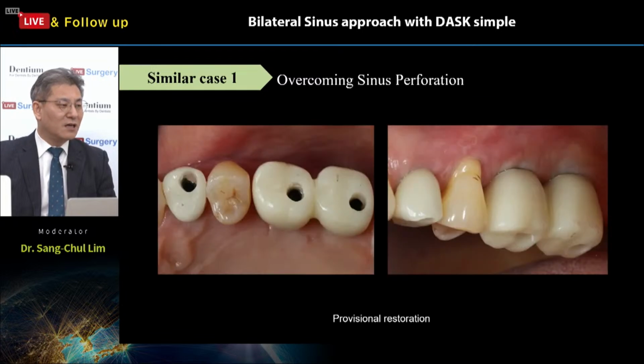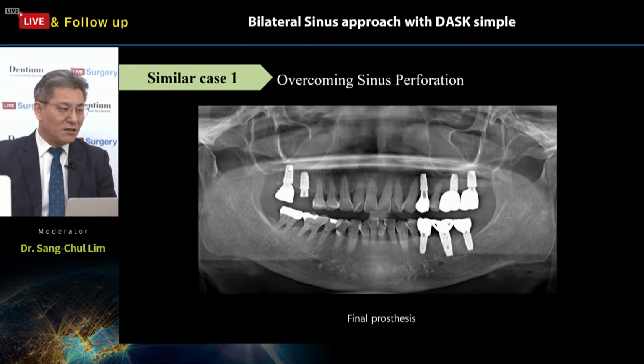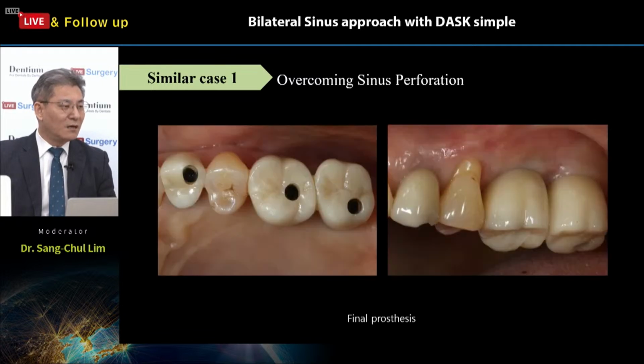But anyway, Dr. Chung is using PMMA temporization and a progressive loading procedure until the final restoration, and 2 or 3 months later, the final zirconia customized abutment and final restoration are delivered to the patient's mouth. Okay, like this one.